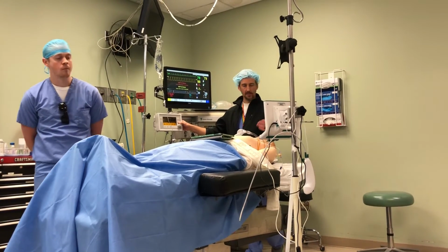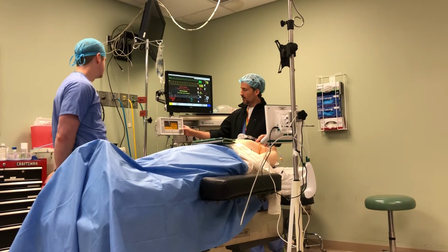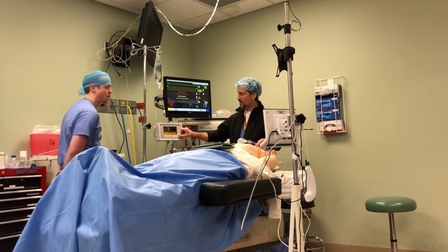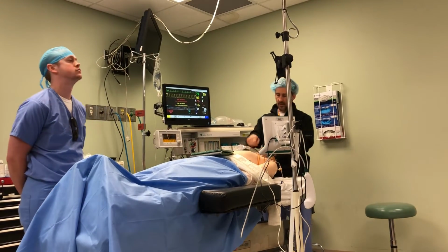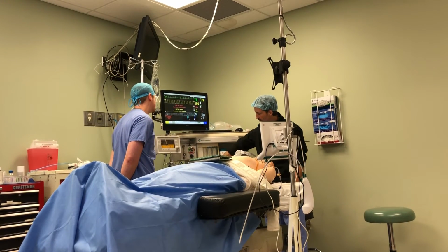For clinical practice, for real life, to get this type of machine on PSV Pro, you hit the little papers. You go to ventilation mode, you click it, you go down to PSV Pro, click it again, you set your pressure support. It's patient dependent, but I'll just say for him 5, and we're good. I verbalize it, I'm gonna take this, and I'm good. Agent's on, gotta turn my flows down, see? So we'll go down to 1 and 1.